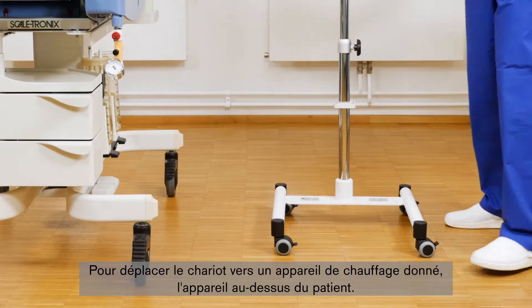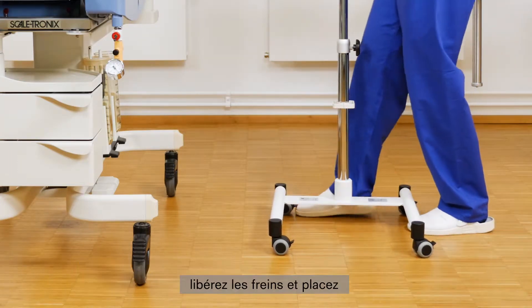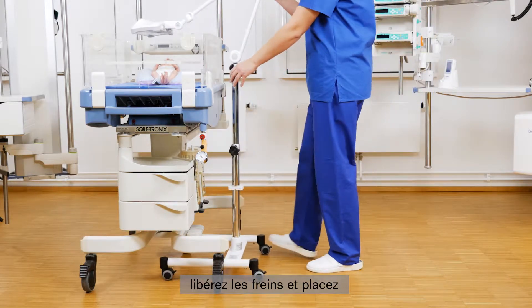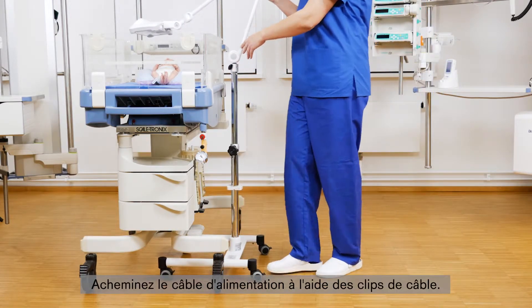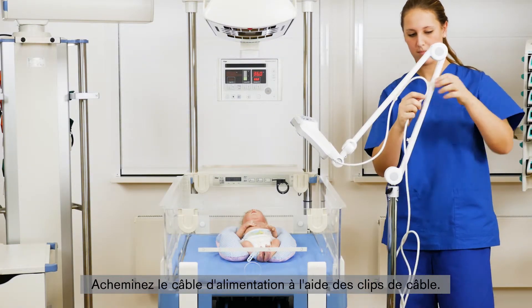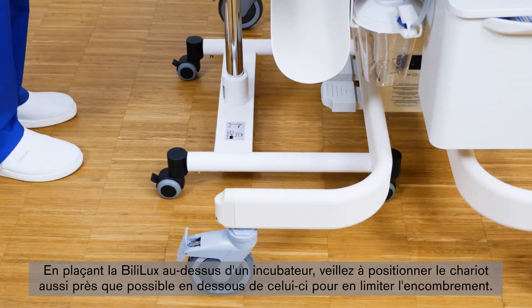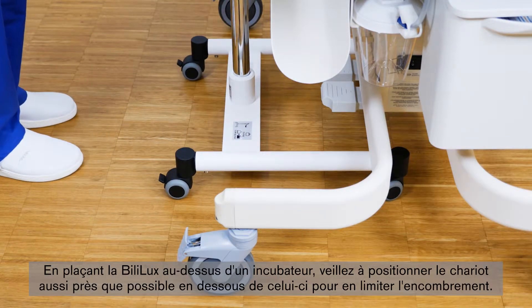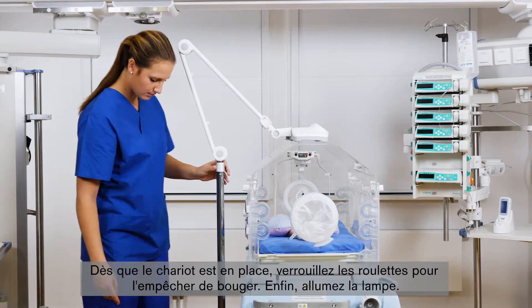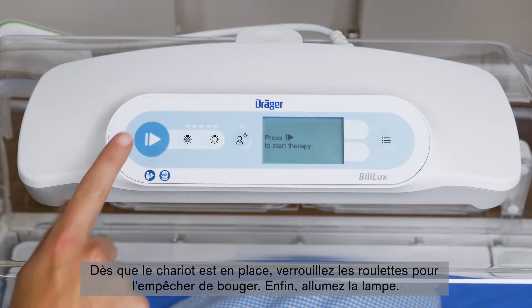To move the trolley, the brakes have to be released. Move the trolley to the warming device and position it above the patient. Guide the power cord cable through the cable clips. If you position the Bililux above an incubator, make sure that you position the trolley as close as possible below the incubator to have a small footprint. As soon as the trolley is in the right position, the casters have to be locked to prevent movement. Finally, switch on the light.